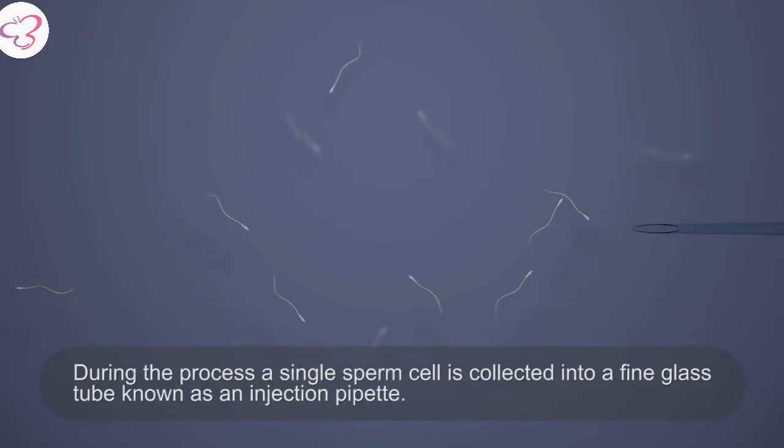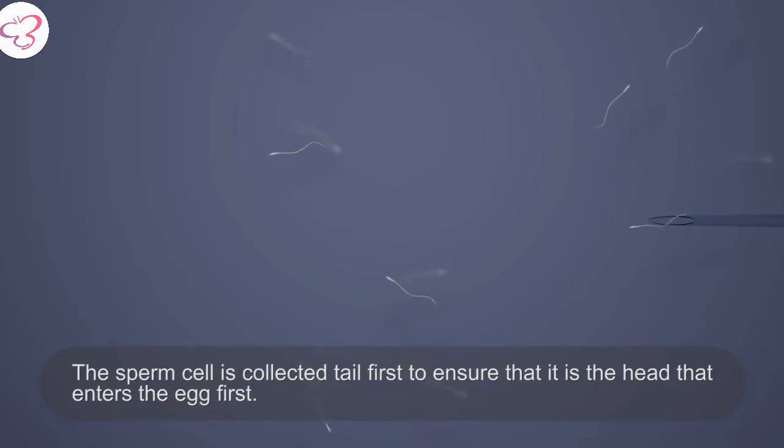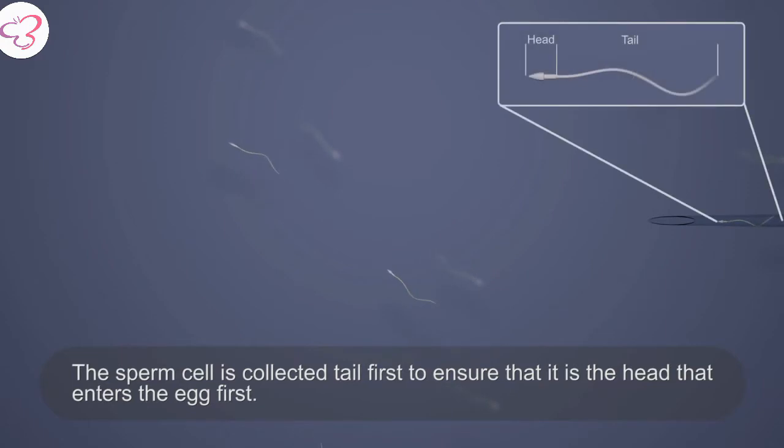During the process, a single sperm cell is collected into a fine glass tube known as an injection pipette. The sperm cell is collected tail first to ensure that it is the head that enters the egg first.